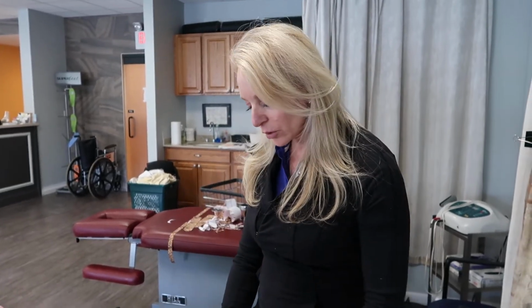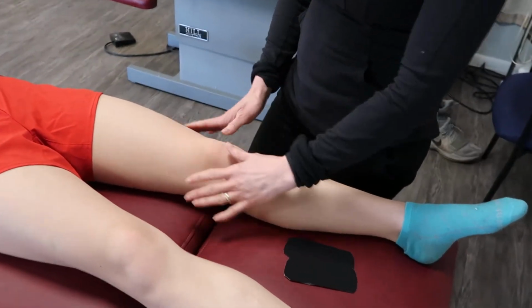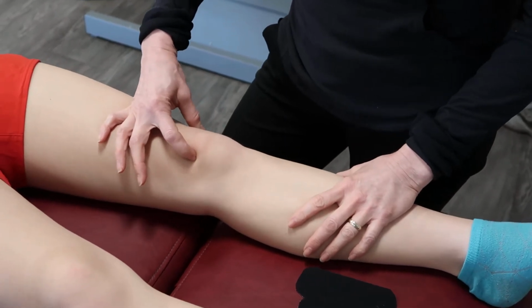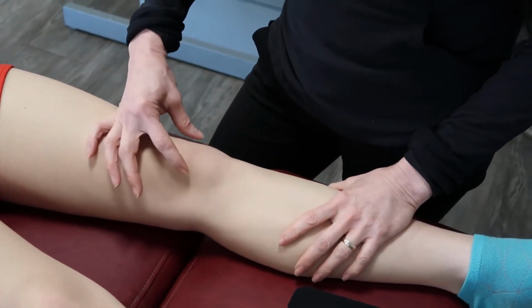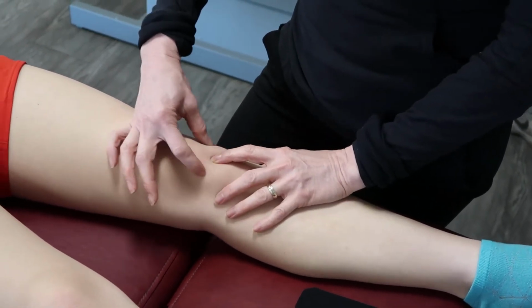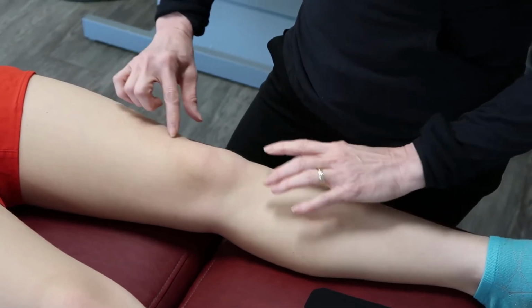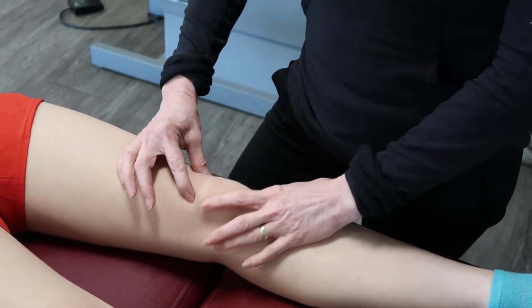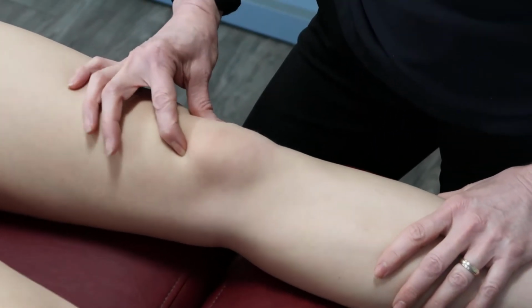good patellofemoral alignment. So basically, if we look at the patella of the patient, our tape might be slightly applied differently depending on how that patella is sitting. So we're going to mobilize it medially and laterally to see how it's gliding and kind of imagine that shape, almost like that heart shape of the patella, and see which way it's tilted. So for this particular patient, she's tilted laterally and also rotated superiorly. So the patella is kind of sitting in this plane right here.